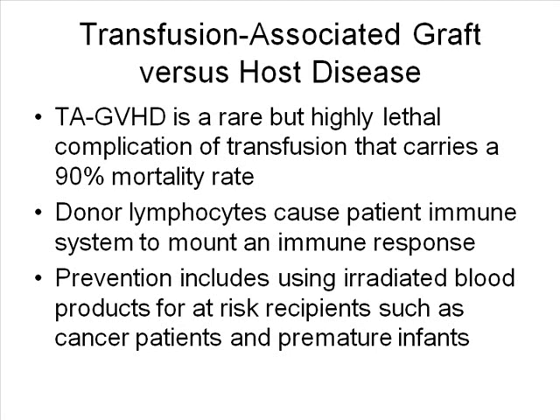What is interesting is we got a patient who had come before she had the bone marrow transplant, and she was an A. And after the bone marrow transplant, she typed as an O. And of course, we scratched our head because we're like, wait a minute, isn't this the same patient? And we looked back, and she had a bone marrow transplant from somebody who was an O, but it was HLA typed.